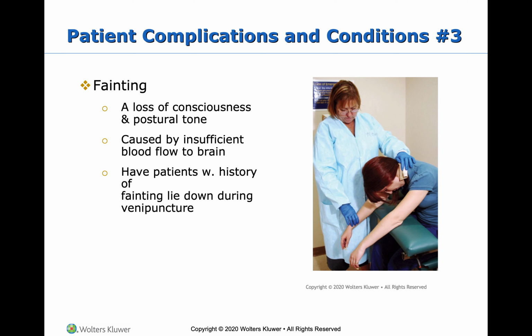If you are in the middle of a blood draw and this happens, let me talk to you about how you'll know that a patient's about to faint. Because if you are in the process of drawing their blood, the needle is in their arm, and you can tell they're about to faint, you're going to want to immediately pull that needle out and prepare yourself for them to faint. Okay. So the patient will get really pale.